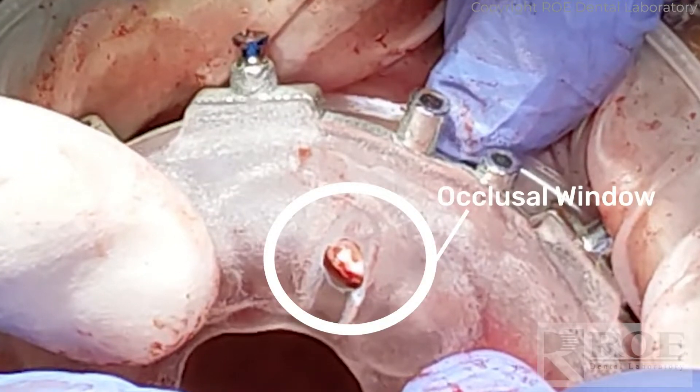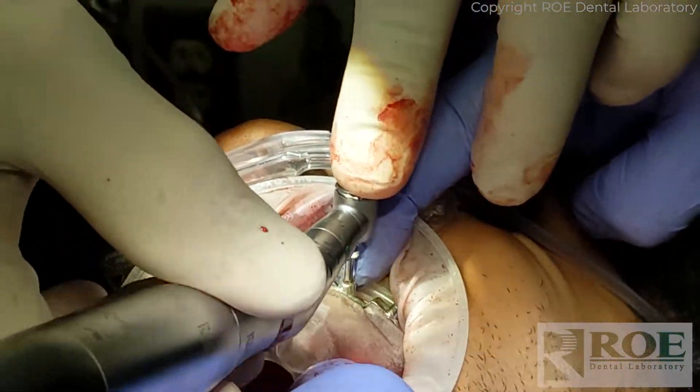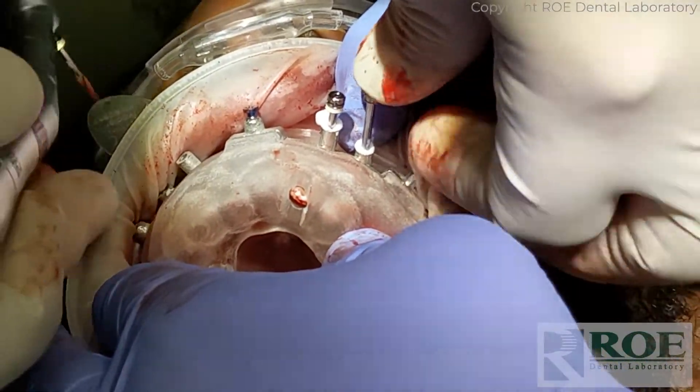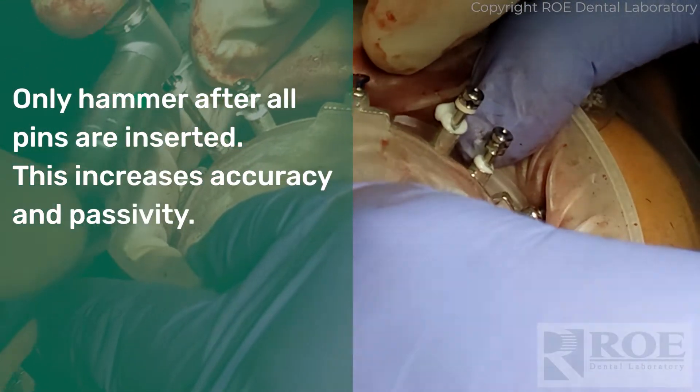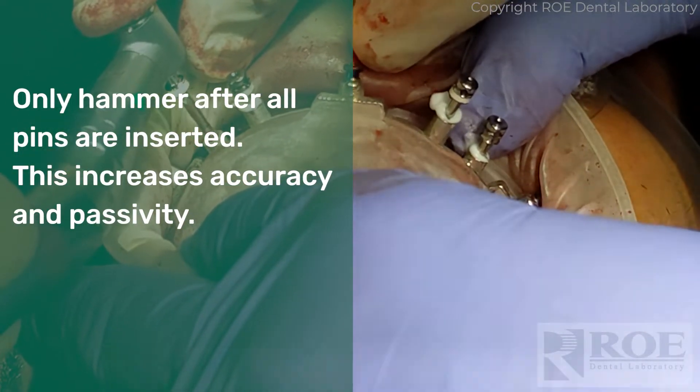Once seated with the fixation base, the drilling and pinning can commence. While holding the pin guide firmly in place through the entire process, the doctor must drill one site at a time and place each pin after the site is drilled. Do not hammer the pin into place until all pins are inserted. This will increase accuracy and passivity of the pin guide.